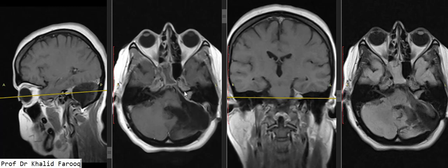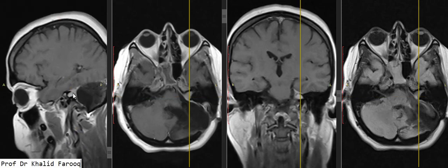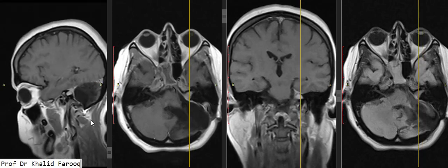This is the axial post-contrast image, this one is the axial FLAIR sequence, and we can see coronal images. The seventh and eighth nerve complexes on the right side, and this is the mass in the left internal auditory canal. On sagittal images we can also see the mass in the left internal auditory canal. So this is an example of residual or recurrent left-sided vestibular schwannoma or acoustic neuroma.